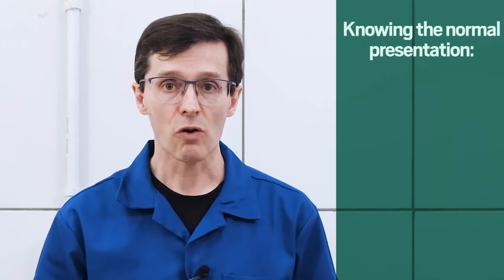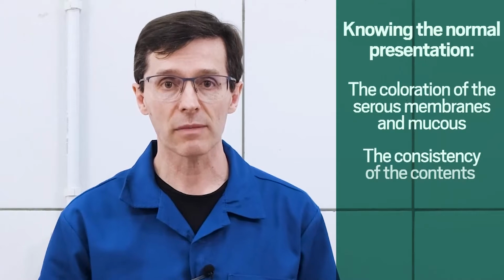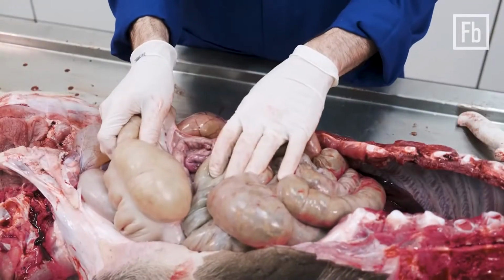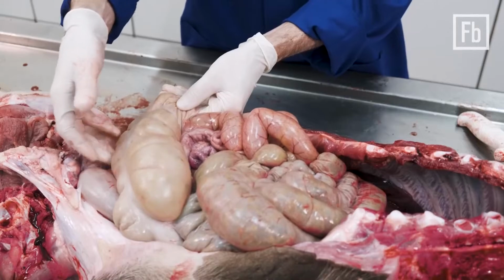For a correct analysis of the alterations caused by the different diseases, it is important to know the normal baseline of the intestines, such as the coloration of the serous membranes and mucus, the consistency of the contents of the different segments of the intestines, and normal intestinal wall thickness. Knowing how to identify the different segments of the intestines is also very important, because different agents cause their lesions in different locations. To facilitate localization, it is suggested to identify the cecum, this thicker portion with a cul-de-sac shape, which is part of the large intestine.